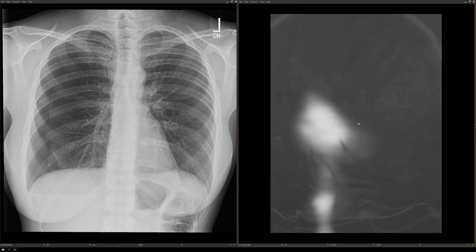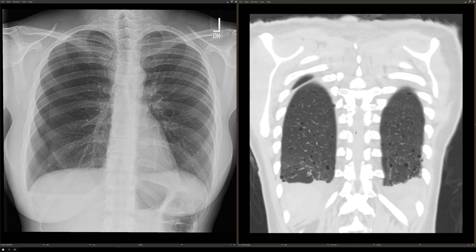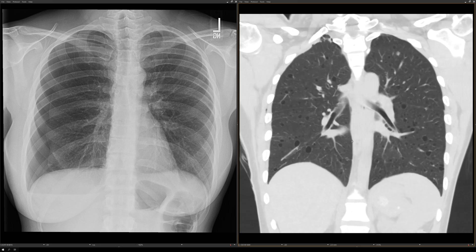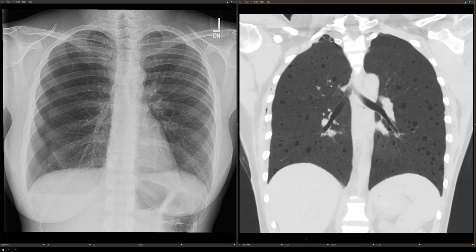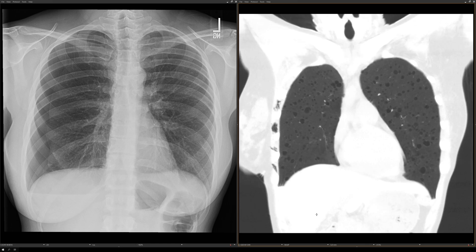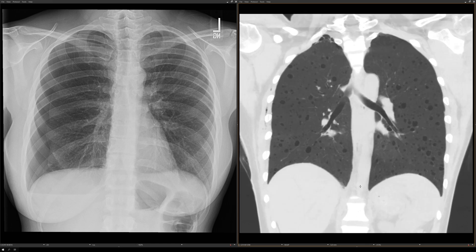A couple of other things you can do: look at coronal images to assess the apical to basilar gradient. And if you're having trouble deciding whether there are cysts, you can use minimum intensity projection images, which make the cysts stand out even more. This is a classic case of LAM in a patient who presented with a pneumothorax, and the pleural effusions turned out to be chylothoraces.